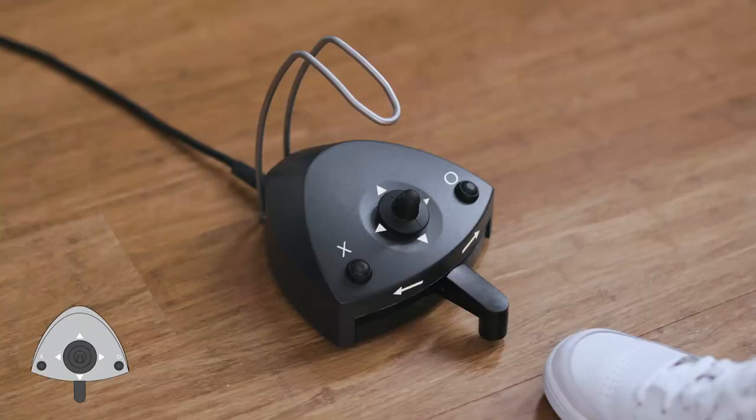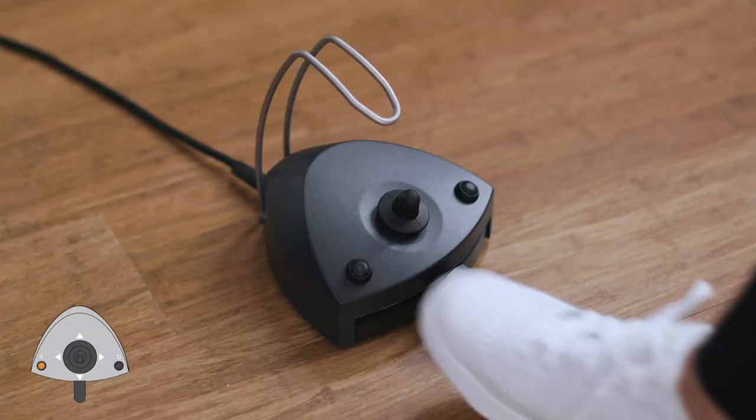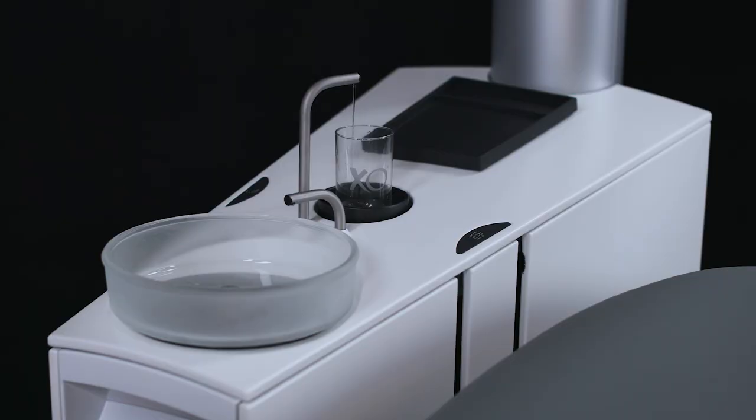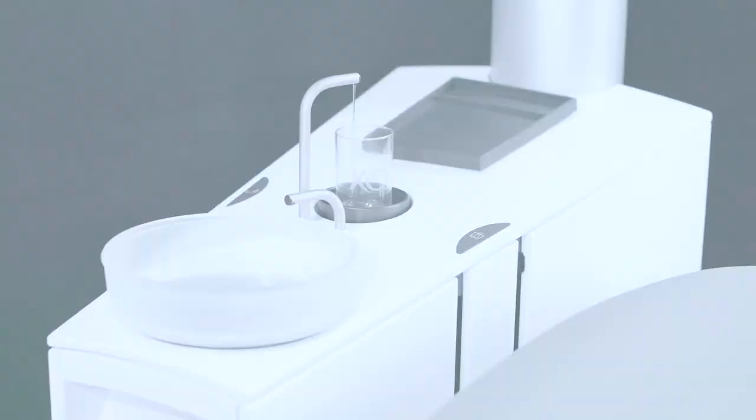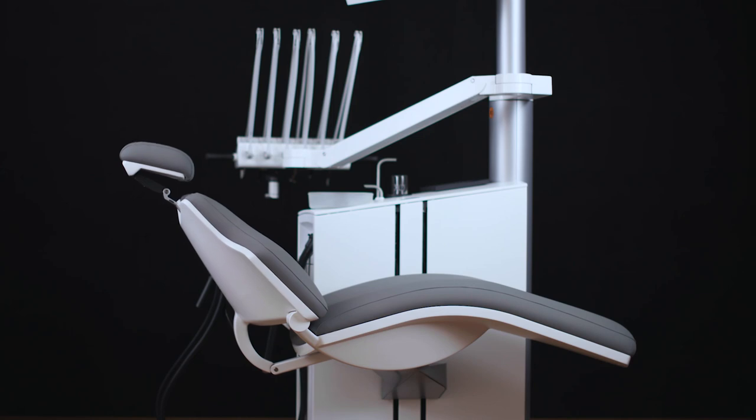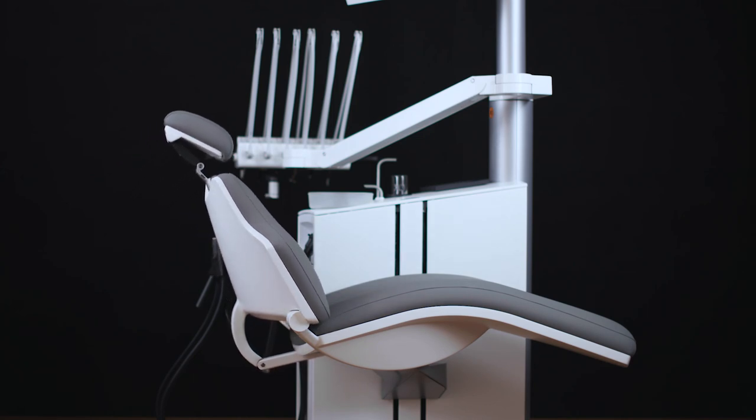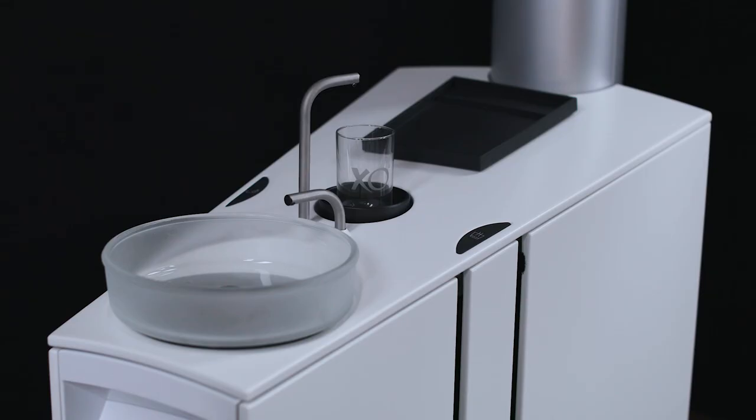Alternatively, the cup filler may be activated or deactivated using X while all unit instruments rest. The cuspidor flush will also start automatically when the patient chair reaches the entry position.